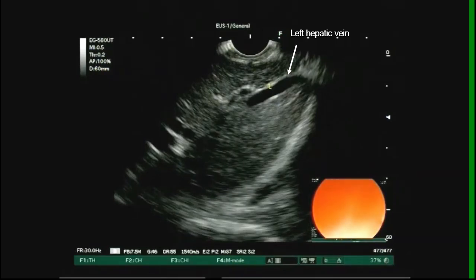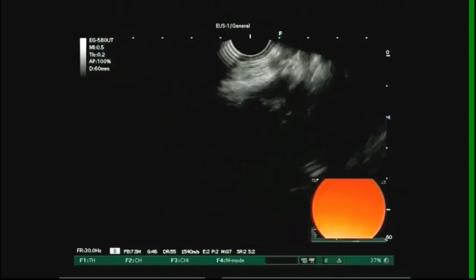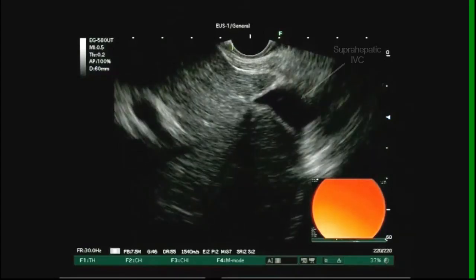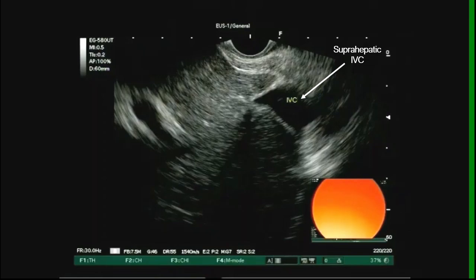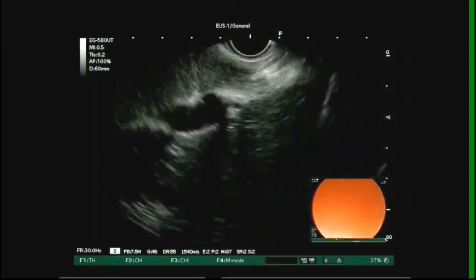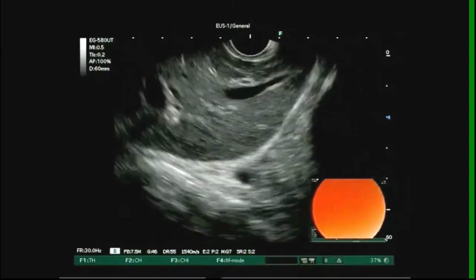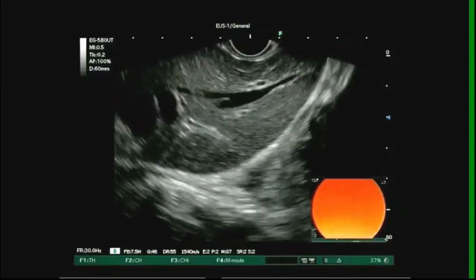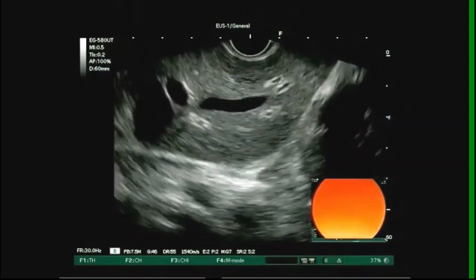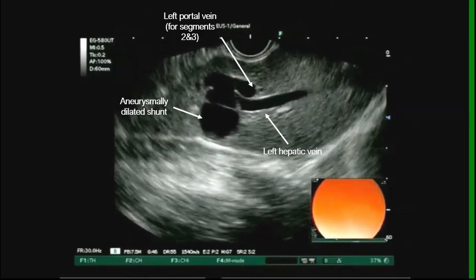With the scope in the proximal stomach and in the open angle position, the left lobe of the liver is identified. You can see here the left hepatic vein entering the suprahepatic IVC. The left hepatic vein is seen again, and here you see the left hepatic vein communicating to the left portal vein through an aneurysmal communicating vessel.